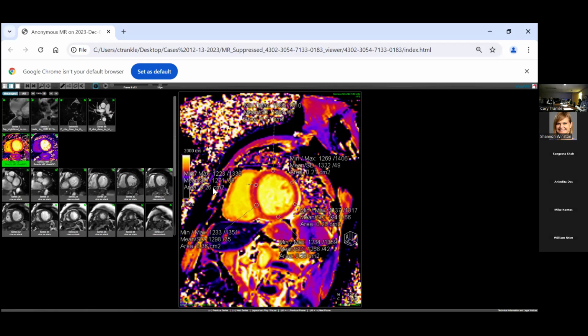But you've got 2000. So what do we do? We have to switch to color because your eyes can see many shades of color. So that's why these maps are in color. They're displaying for you the hydrogen nuclei in the voxels that make up the picture.